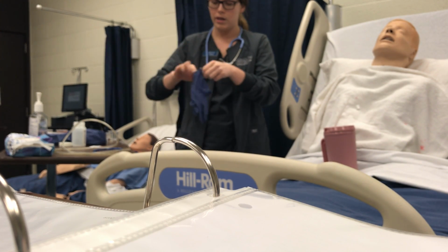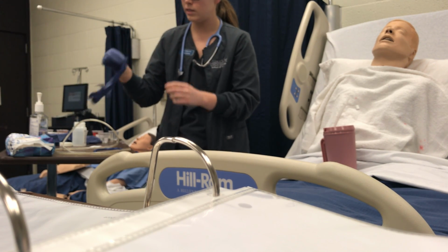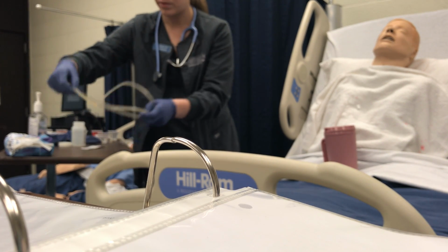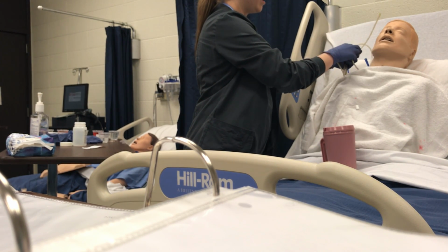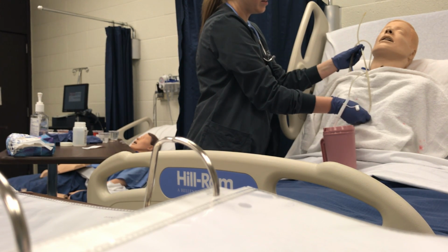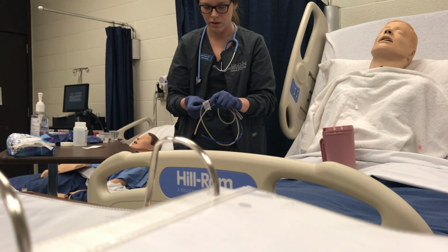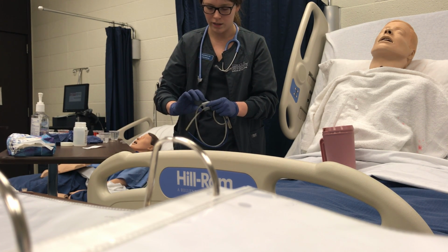So we're measuring this tube. We're going to do it from the nose to his ear, and then down to the xiphoid process, and then I will mark that. Okay, so like I said, it will measure from the nose to the ear, and then from that tip of the ear down to the xiphoid process. Okay, and so then I'm just going to place a piece of tape that I have ready to go, just so I will know that that is my marker.